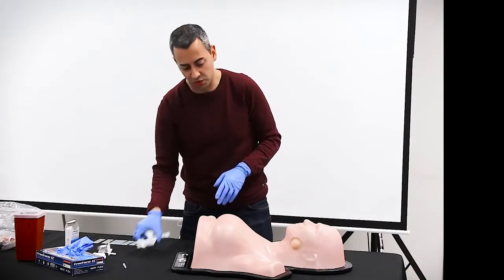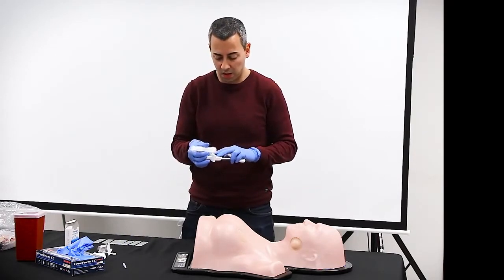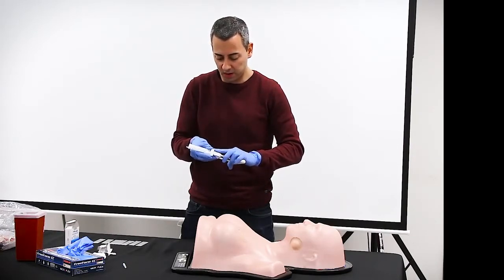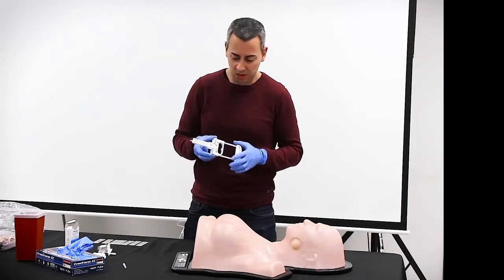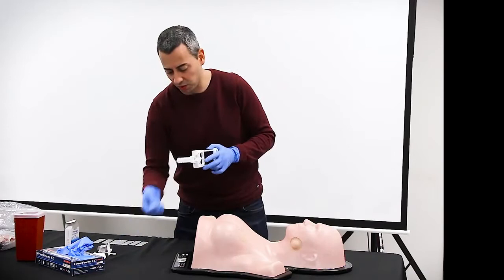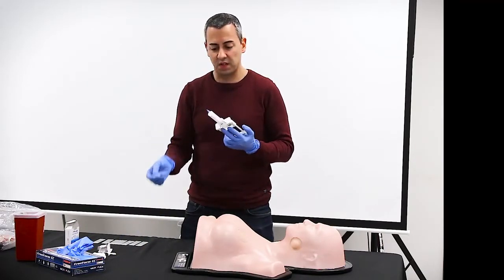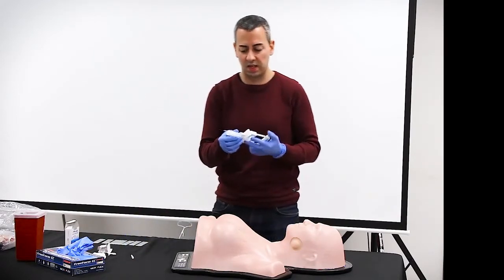So now it's important to assemble the system. There are different methodologies, but the widely used one is the aspiration one. So you need a holder like this. You assemble the syringe, and then you assemble the needle. 25 gauge is enough, or 23, no more, because we don't use anesthesia.